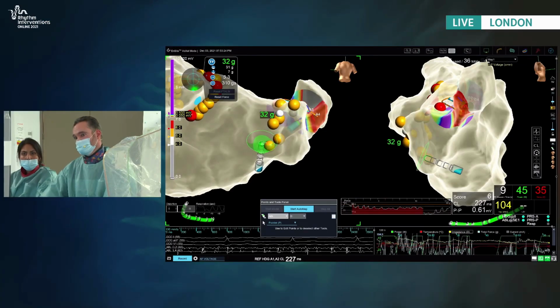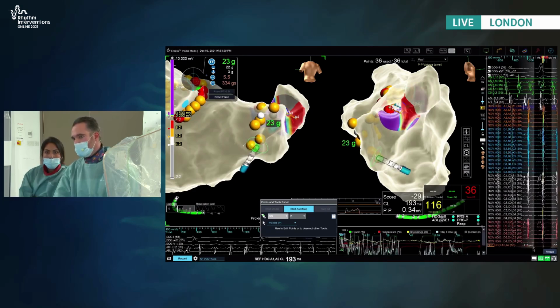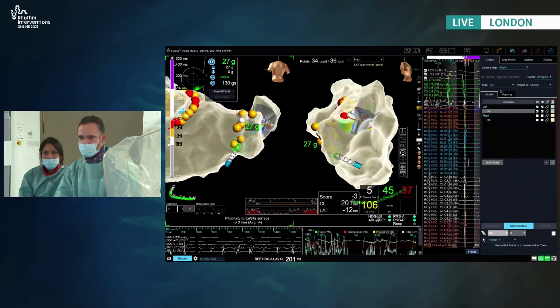Ross, may I ask what the strategy is here? Are you just aiming to isolate the pulmonary veins, or are you going to consider any other lesions outside of that? Horses for courses, yeah. I was intending to isolate the veins and then see how the cycle length everywhere looked. Obviously you don't get to see voltage maps and things until you've started the case.